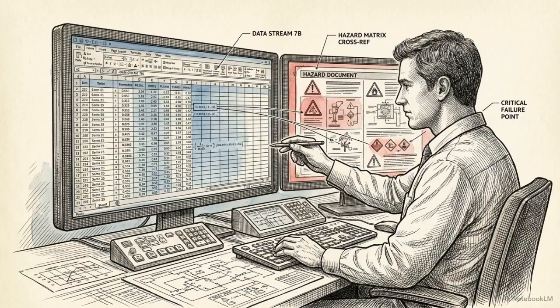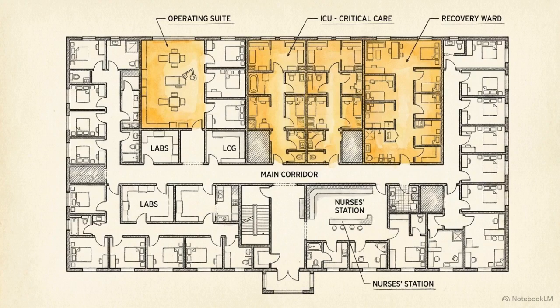Biomedical staff take the lot numbers from the hazard notice and cross-reference them against this central ledger to pinpoint exactly which departments hold the defective inventory.